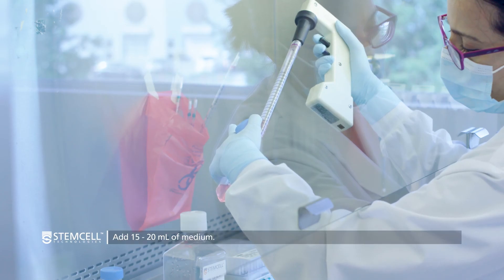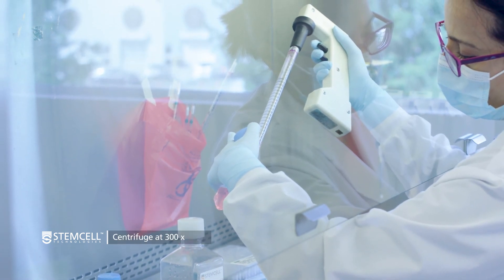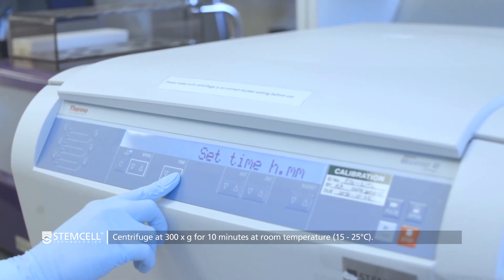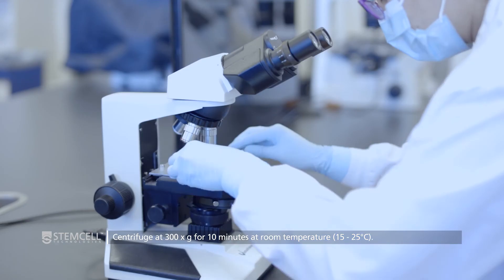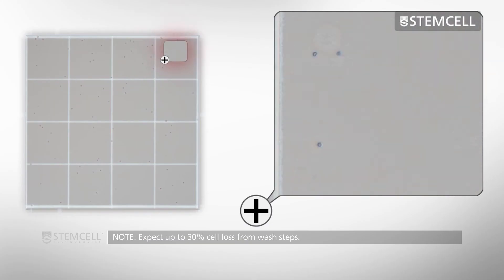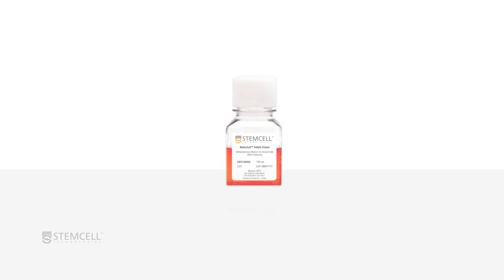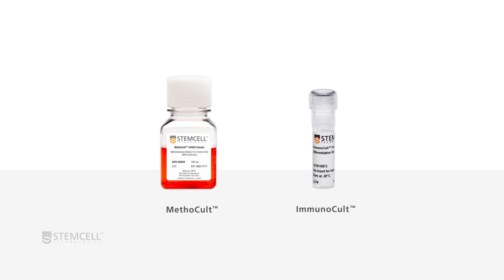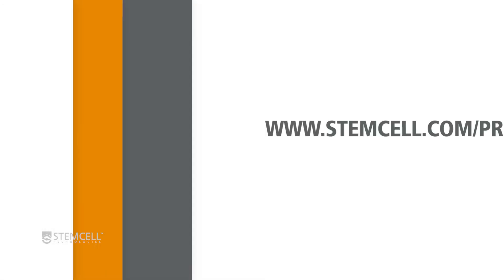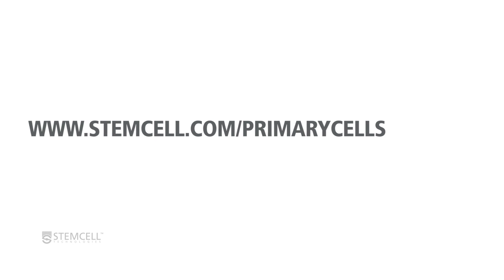Wash the cells once more by gently adding 15 to 20 milliliters of medium to the tube and centrifuging the cell suspension at 300 times G for 10 minutes at room temperature. Note that cell loss of up to 30% can be expected after the wash steps. Cells are now ready for use in downstream applications, such as cell culture with Methocult or Immunocult, and cell isolation with EasySep. For more information, please visit www.stemcell.com/primarycells.